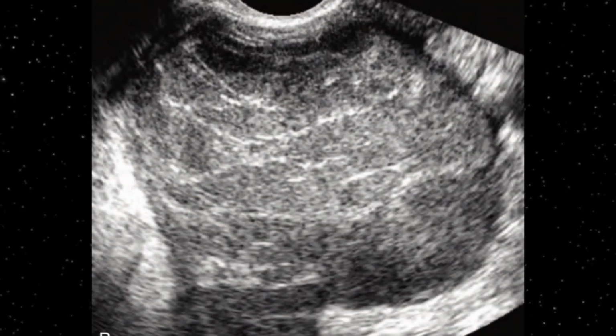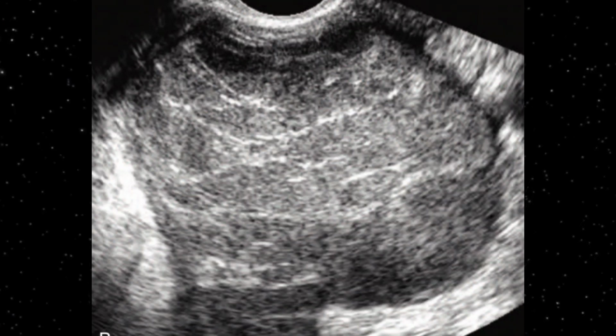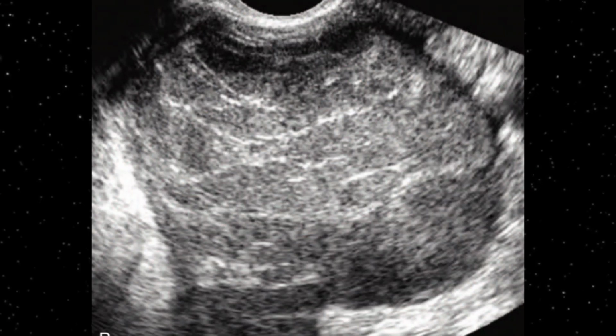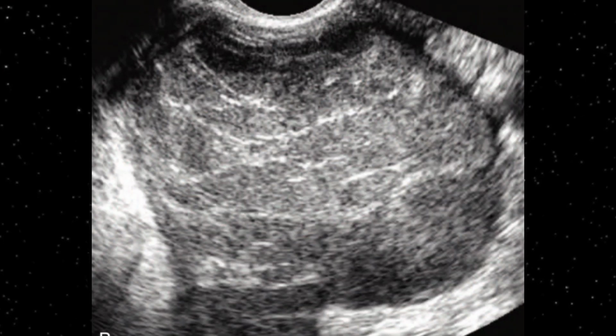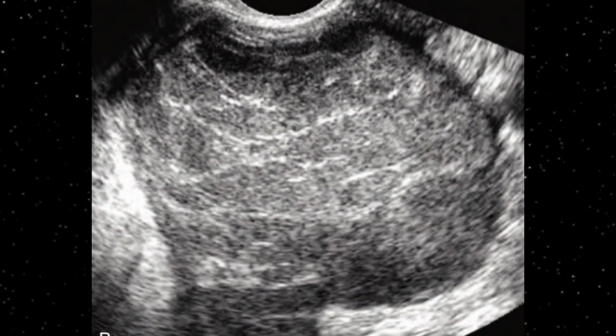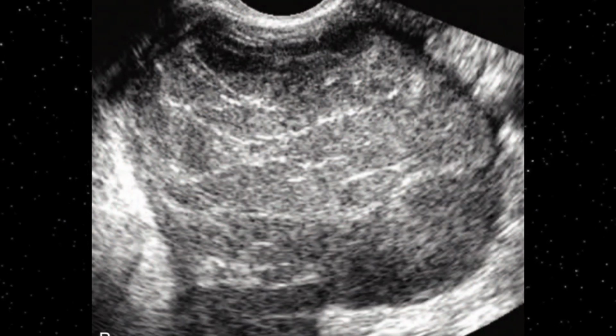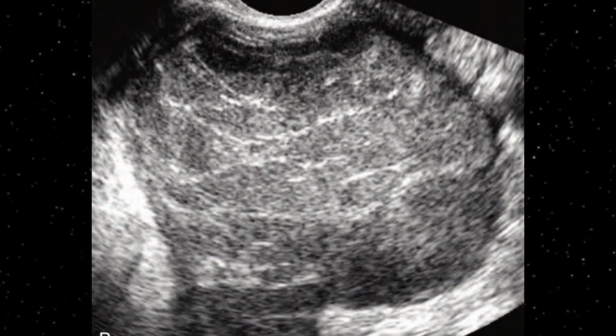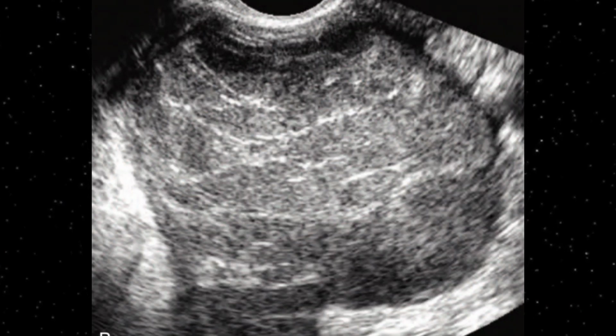This is another presentation of dysgerminoma. This transvaginal scan shows a large, solid ovarian mass with thin linear hyperechoic areas. Here you can appreciate thin linear echogenic areas within the parenchyma of this solid mass.